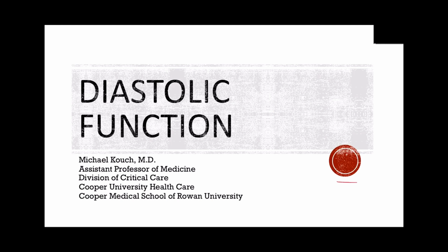Number one, it gives you a baseline understanding of the physiology of your patient's cardiovascular system. So you can really titrate your therapies based on, or limit some of your therapies based on, their diastolic function or dysfunction. And then lastly, you can use diastolic dysfunction as a surrogate marker for your left ventricular end-diastolic pressure at the bedside. You can use it to help you assess someone's volume status.